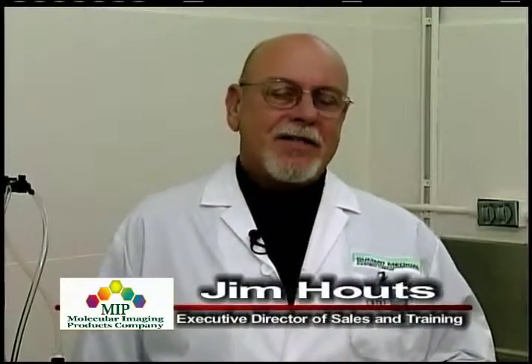I give classes all across the country in inhalant anesthesia systems, and I often get asked this one question. Someone will invariably say, "What are we trying to do here?" And I'll try to give you a very succinct answer to that question. We are trying to deliver a sublethal dose of a toxin to an animal to render it recumbent and non-responsive to pain stimuli. And there's a flip side to this, and that is that we want that animal to recover relatively uneventfully such that we can use that animal for future studies.